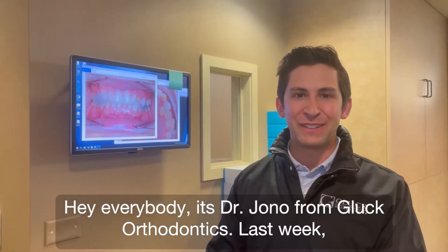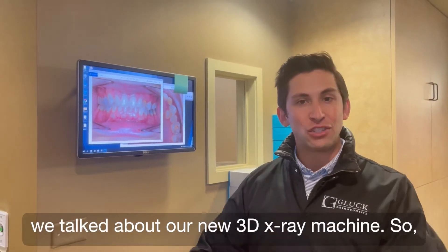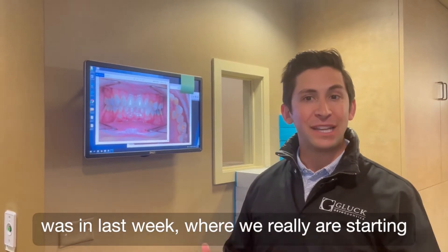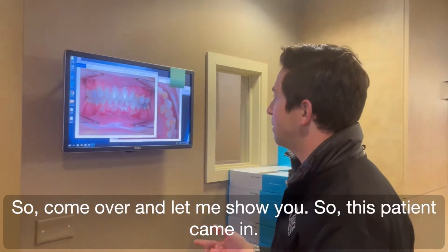Hey everybody, it's Dr. Jono from Gluck Orthodontics. Last week we talked about our new 3D x-ray machine, so I want to show you an example of a patient who was in last week where we're really starting to see the value from having this kind of technology. Come over and let me show you.